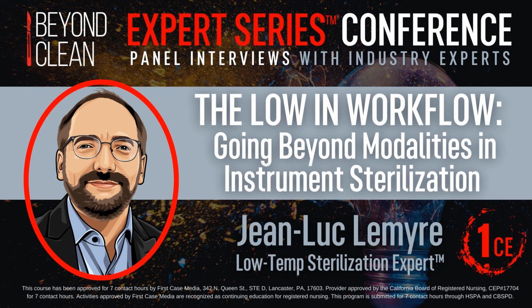So through investigation, we deduced that the tray went through cleaning with a high-level, high pH detergent, which is not good for aluminum trays, and stripped the anodization layer, damaged the tray itself, and some contaminant got lodged. By the naked eye, you would not see it, but these trays were damaged in a way that was impacting the sterilization process. So that's just something important to keep in mind. Cleaning is super important and will impact the rest of the process after.